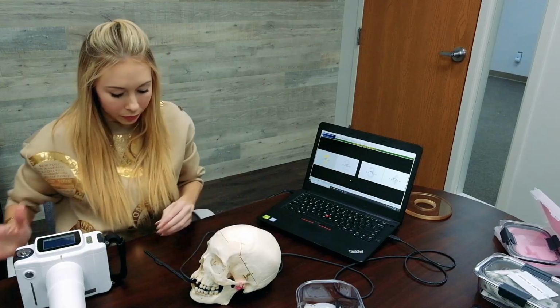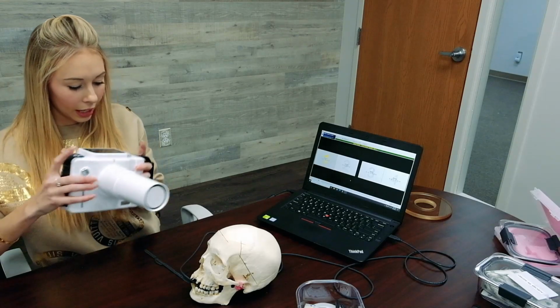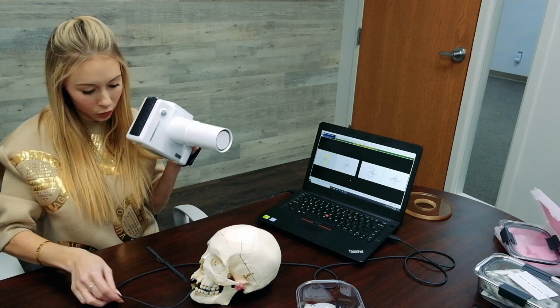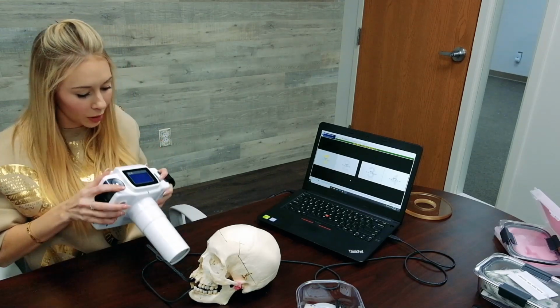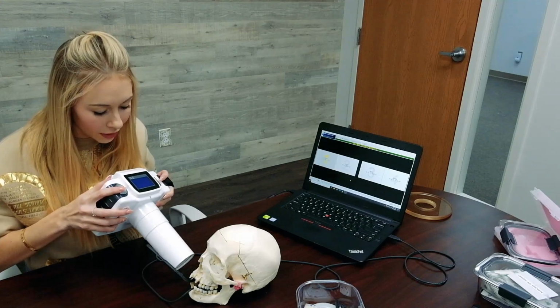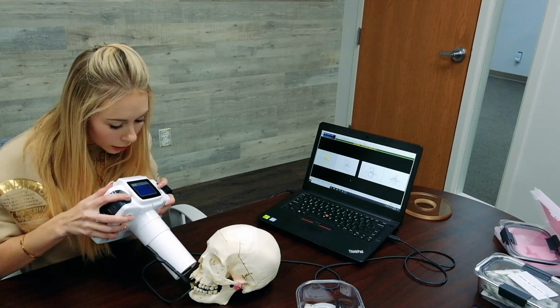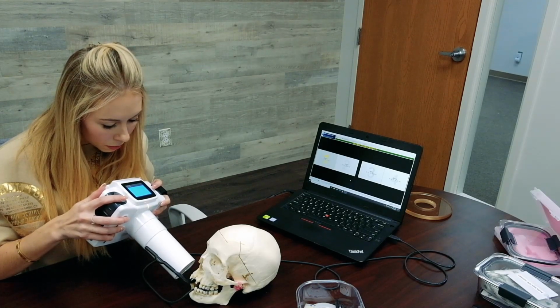Perfect. Now I'm going to make sure this is powered on. And I'm going to line up this cord out of the way. You want to make sure you have right angle ready to take your x-ray image. I'm going to line up the tube head in the center here and on the sensor holder properly. Go ahead and take the first image. I'm properly lined up.